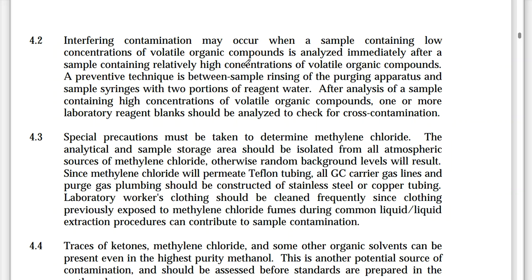containing relatively high concentrations. So what you're going to find here is that in a laboratory, we don't really have any way to know what this sample is going to be bringing to the table. If it's a true sample, with an unknown concentration that we're trying to find, like how much is actually there, we can't really rank them in order from low to high. And that's because we just simply don't know anything about the samples.